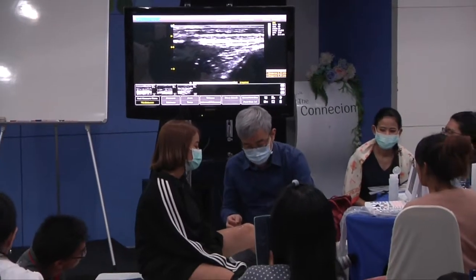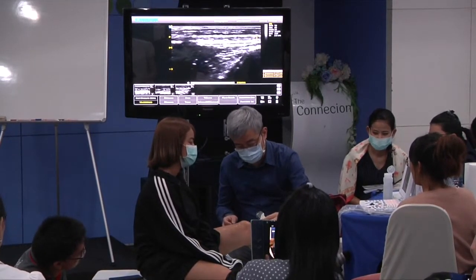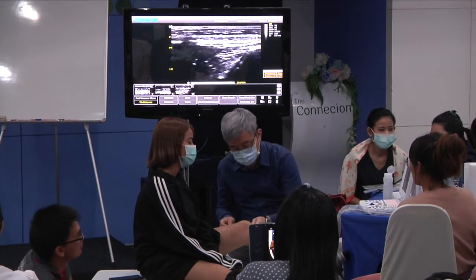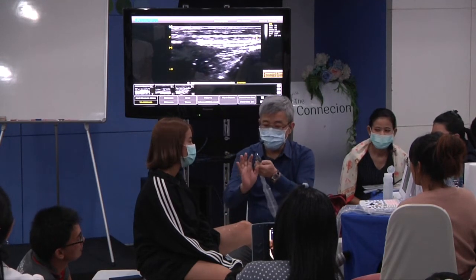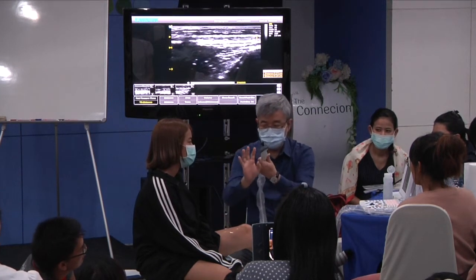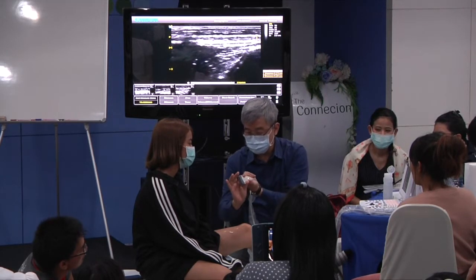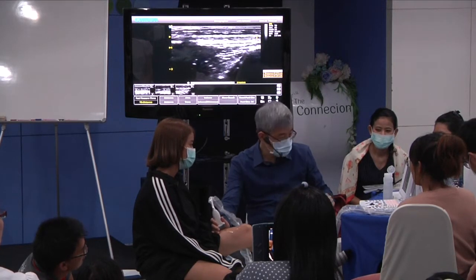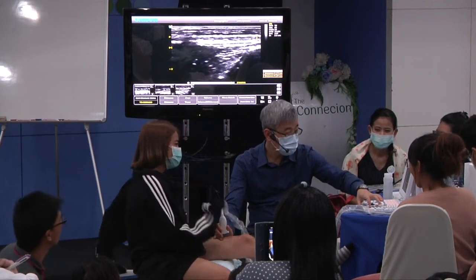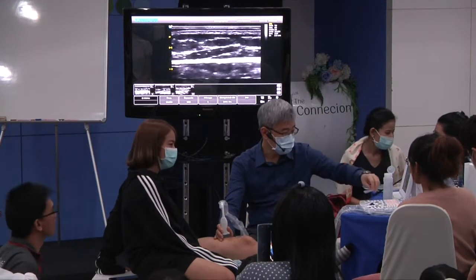Then, I promise, the instructor mentioned some skill for the focus. Point of care ultrasound means you need to use ultrasound in community care. Okay, just relax. Oh, too much fat, sorry.